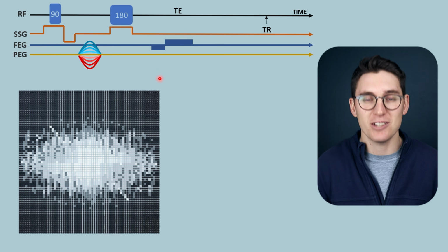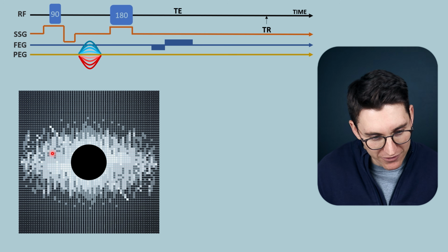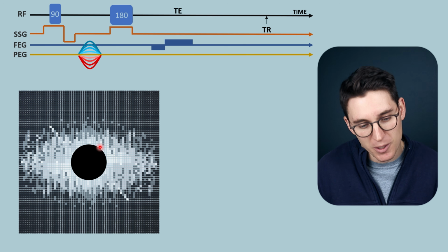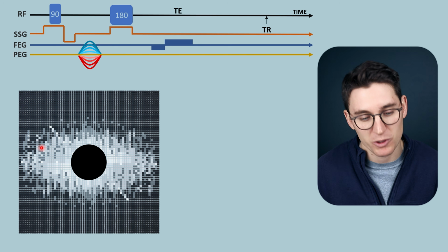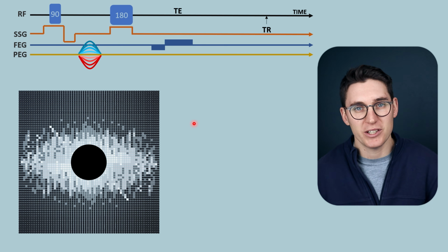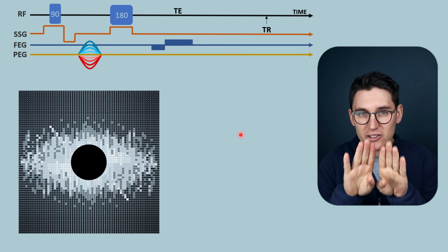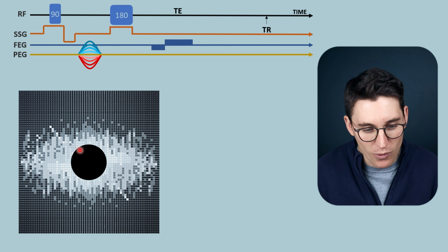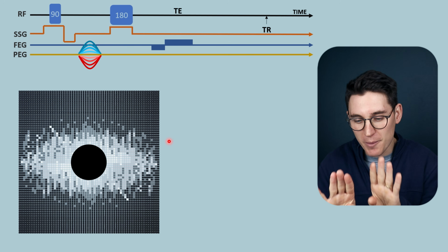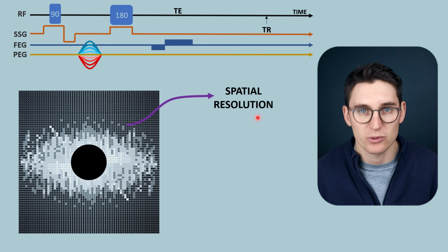Now, if we were to look at the inverse of this, we were to isolate only the peripheral signals coming from K-space, what we have now is multiple phase encoding steps and multiple frequency encoding steps, but we are losing a lot of the signal amplitude that's coming from the center of K-space. So the image that we would generate if we did a two-dimensional transformation here would give us very good spatial resolution, would give us very good definition between the edges of tissues. However, we won't be getting much contrast in that image. We won't be able to tell different types of tissues apart very well, but we will see where those boundaries are. The peripheries of K-space is giving us what's known as spatial resolution.